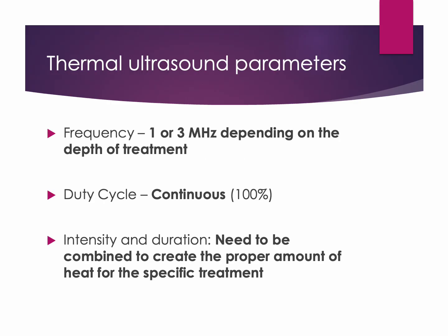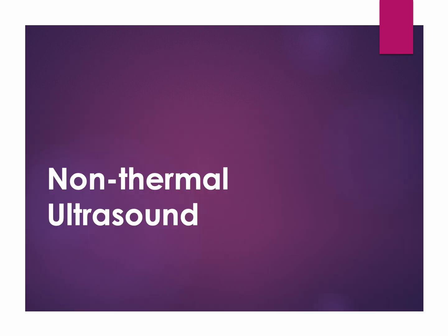In summary, for thermal ultrasound, use continuous mode to create heat, select the frequency based on depth of treatment, and adjust intensity and time to achieve the desired heating effect. Now let's shift to non-thermal ultrasound, which focuses more on cellular and tissue healing mechanisms.